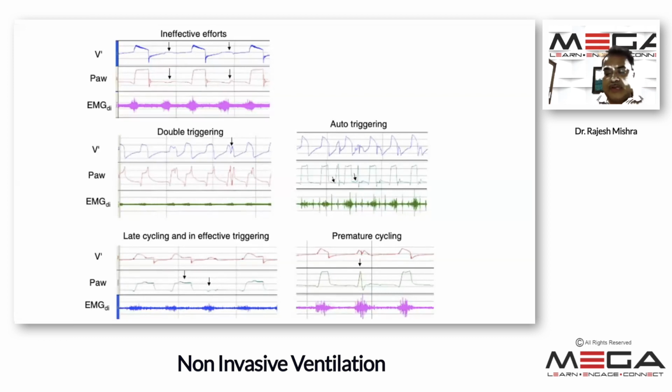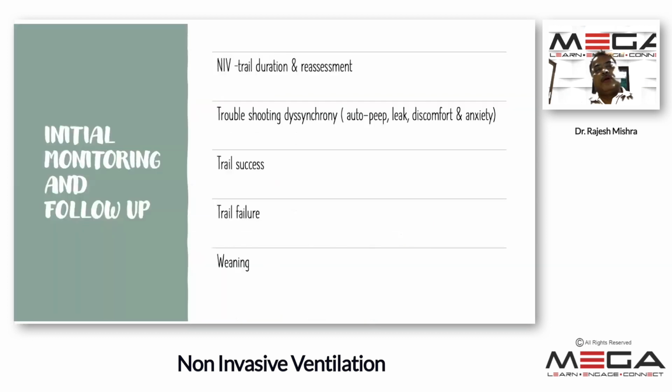More and more patients become tachypneic, more and more asynchrony happens, more work of breathing will happen, and the patient will have more lung injury. So we want to give NIV to take care of the work of breathing and to reduce the lung injury. But if the patient remains tachypneic, does not breathe properly, does not synchronize with the NIV, then this can contribute to more problems.